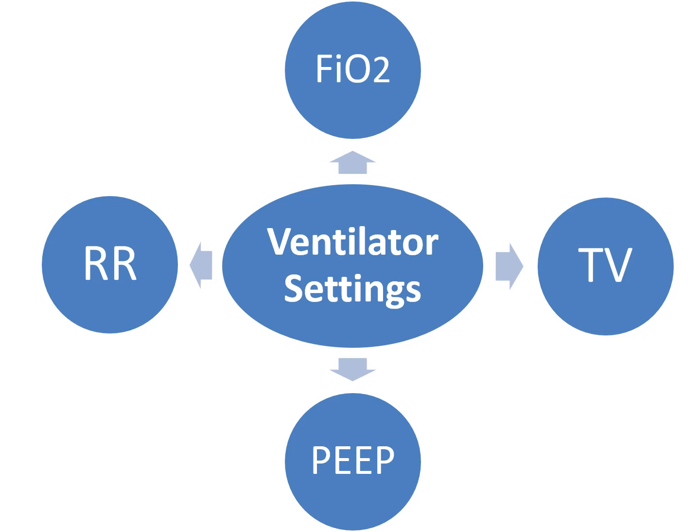The person who can make ventilator settings in the institution is also something that you should know. And many people refer to the respiratory therapist for guidance as to what settings to use and how the patient tolerates it.